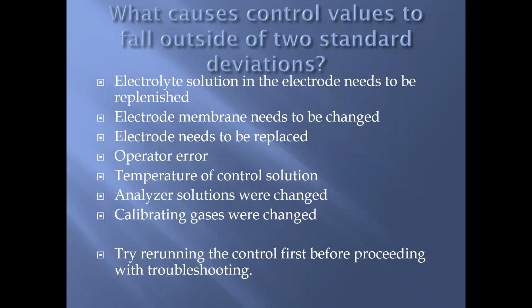All right, I guess that's just the old machines. What about Broward Health, doesn't have the ABLs on wheels, right? They have a blood gas room. All right, so next time you're in the blood gas room, look to see if the machines have little cylinders of gas that are used for calibration. And let me know.